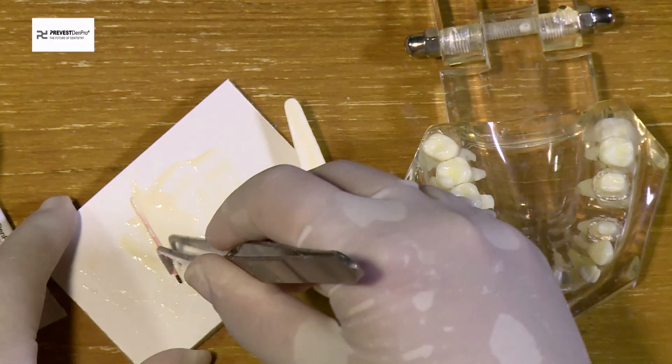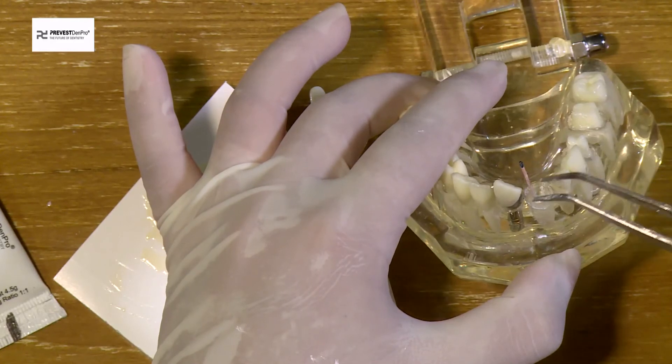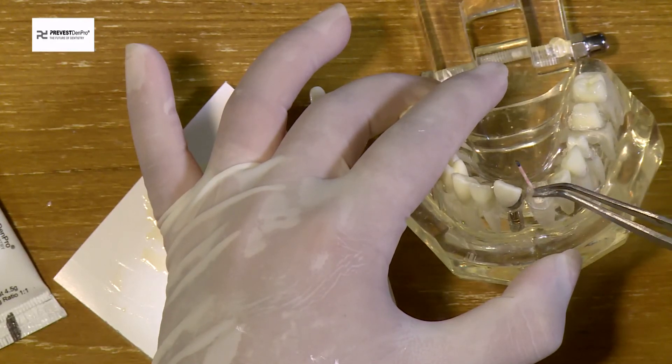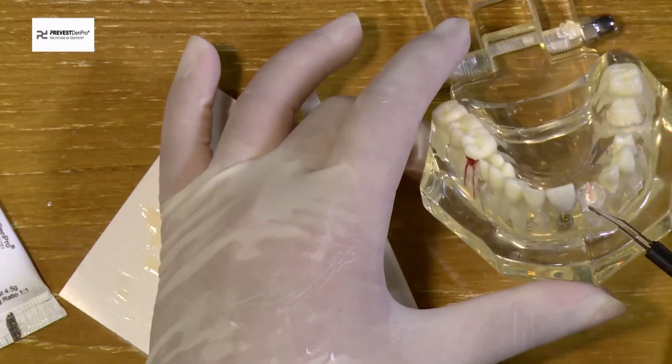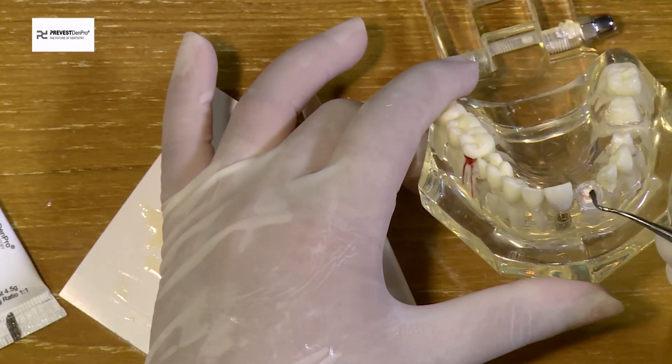The gutta percha cone is coated thoroughly with the sealer and placed into the prepared root canal space. You can appreciate the sealing property of the sealer. The excess gutta percha is seared off and condensed into place.